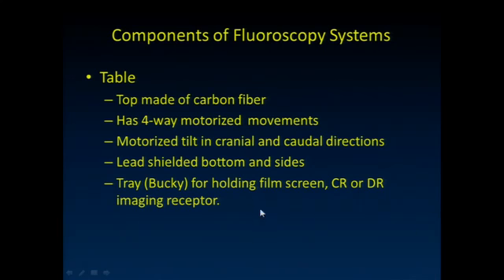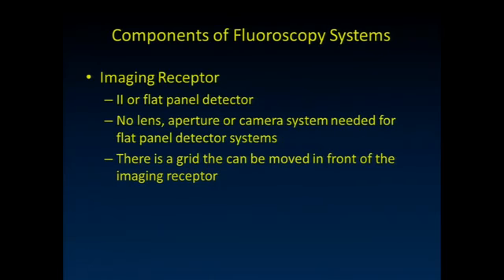This is in regard to a GI fluoro unit, and I'm actually going to show you one of those and talk about it in specific at the end to just remind you how some of the things that we talked about in these first two talks apply to our X-ray imaging. And I really want to use GI fluoro because that's one of the times when you're in the room controlling the parameters that we talked about necessary to make the image. So components of the fluoro system, that image intensifier or that flat panel detector.